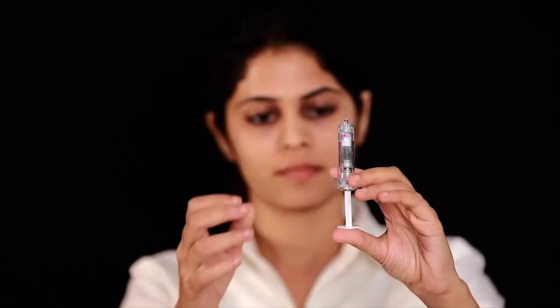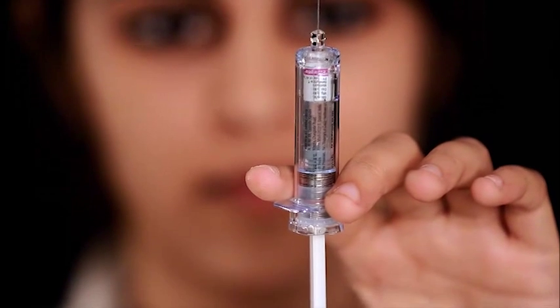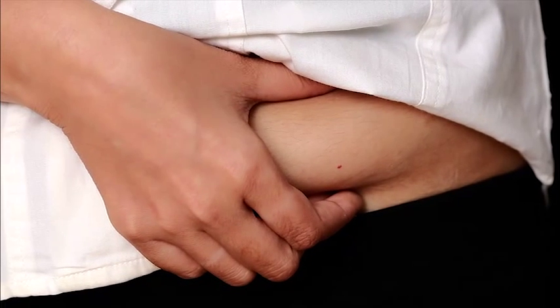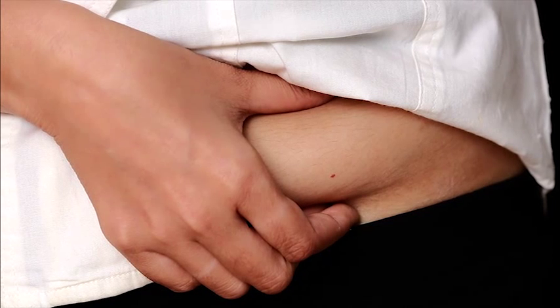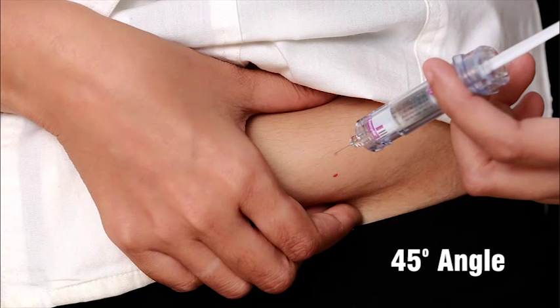Hold the syringe at eye level with one hand so that you can check for air in the syringe. Slowly push the air out through the needle. Hold the body of the syringe in one hand between your thumb and index finger. With your other hand, gently squeeze the area of the cleaned skin and hold it firmly. Using a quick dart-like motion, insert the needle into the squeezed skin at an angle of about 45 degrees.